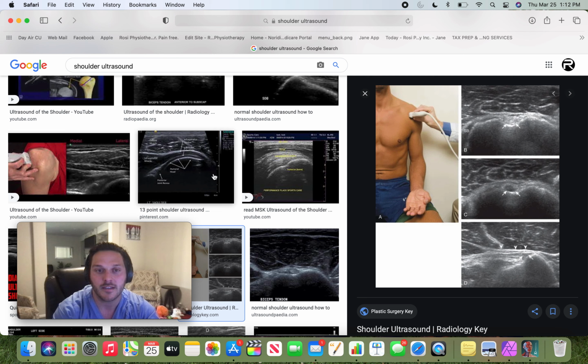Like you can see over here, when we're looking at the infraspinous fossa, the humeral head, there's nothing down below here, and that's okay because there's nothing below these bony areas. So this is just bone. Even if it's a hollow bone, you're not going to see anything beneath it.